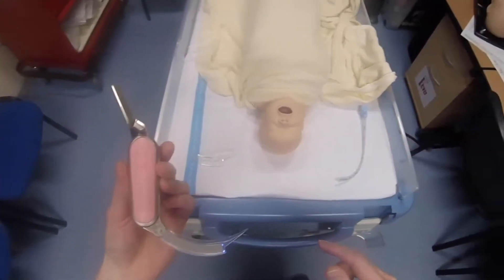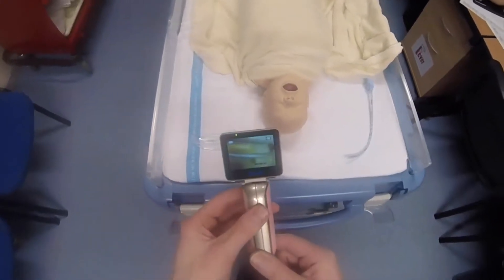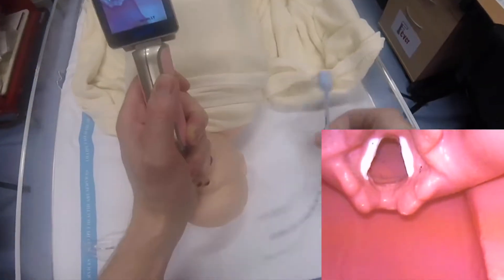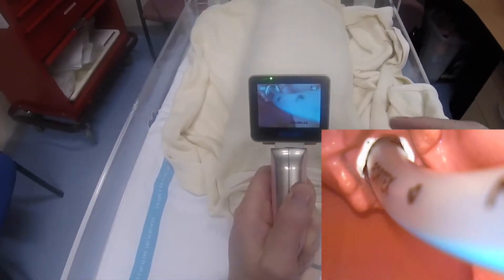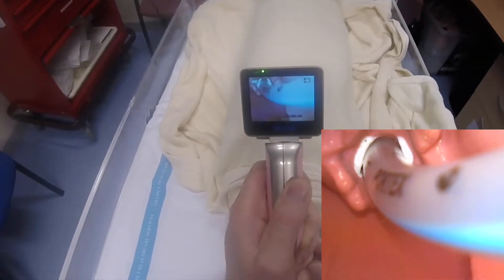I'm going to show how this works on a patient — I've got a neonatal patient model with the N size blade. There's no difficulty at all doing the intubation, and you can see how well-defined the vocal cords and tissues are, and how well-defined the numbers are on the tube.